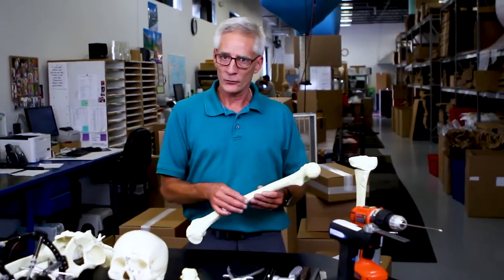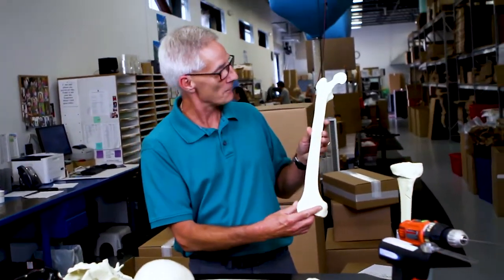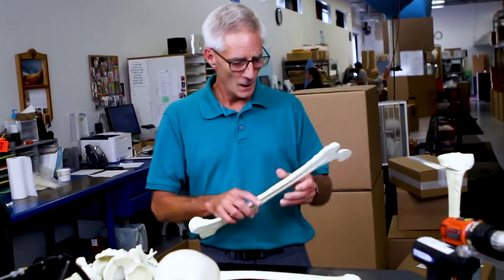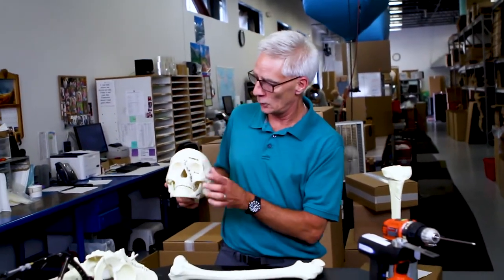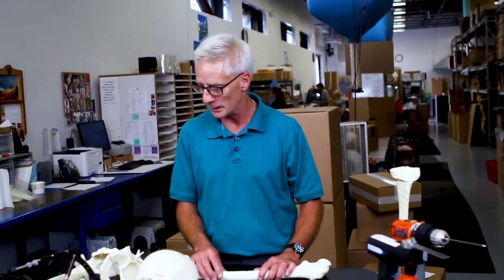The Sawbones Solid Foam is constructed with the same rigid material throughout. Our long bones all have the IM canal, as you can see here, and we can vary the densities of these products — from a real high density product like the skull, where they use very small plates and screws, to a very soft osteoporotic material that you can use to show osteoporosis and the failure of bone.